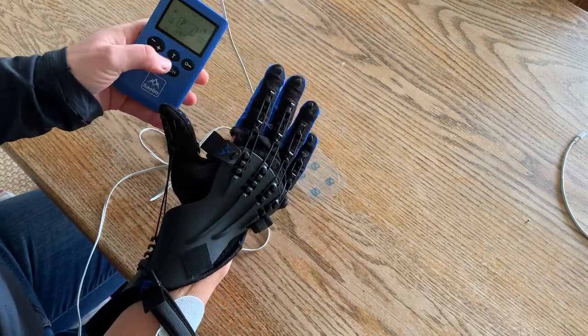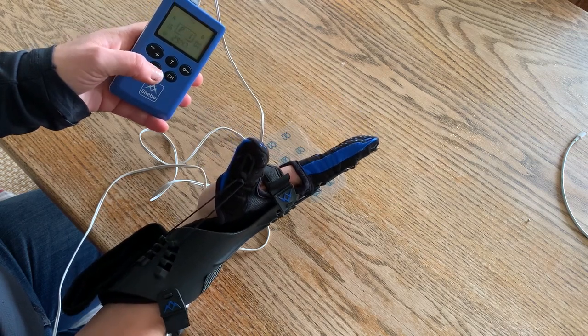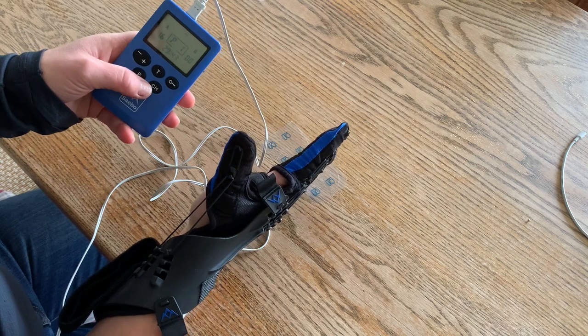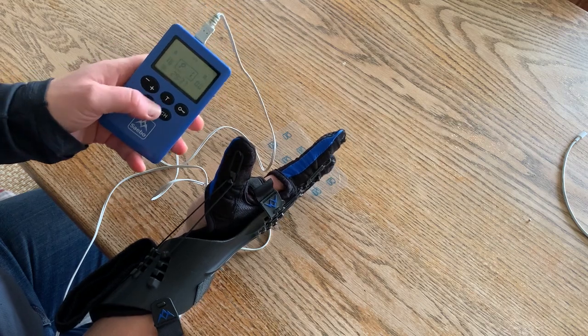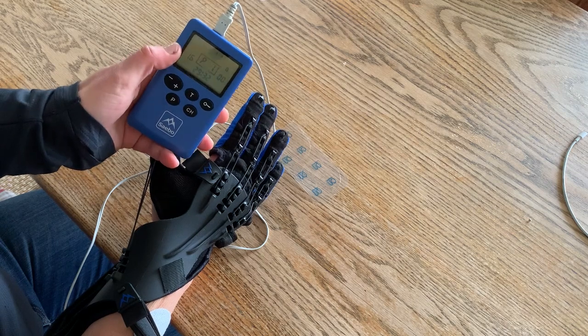Now when I unpause it, the stimulation comes on — you can see the extra opening that it gives. If I want to use that in a task rather than waiting for the timing, then I would rather use the trigger button so I can control exactly when the stimulation comes on.